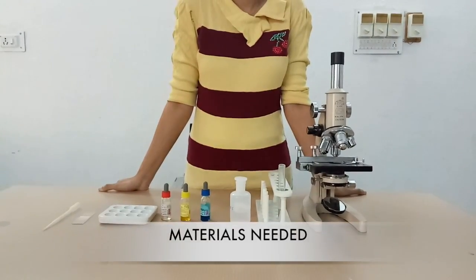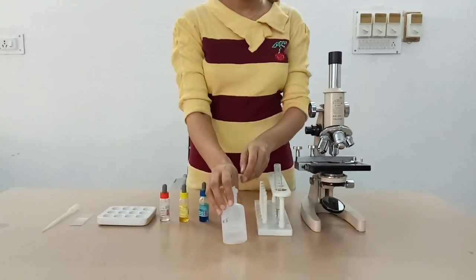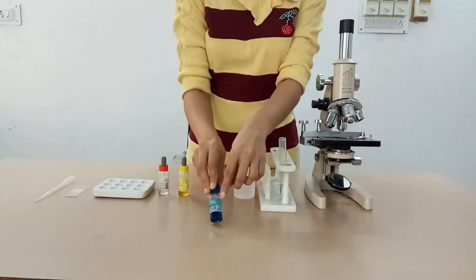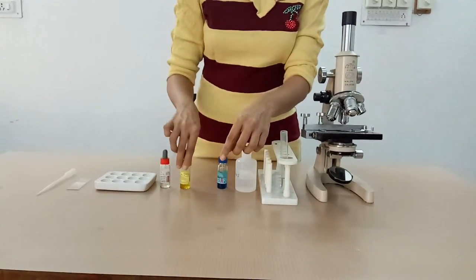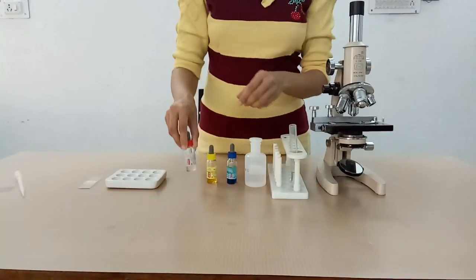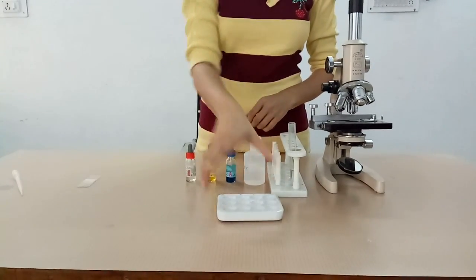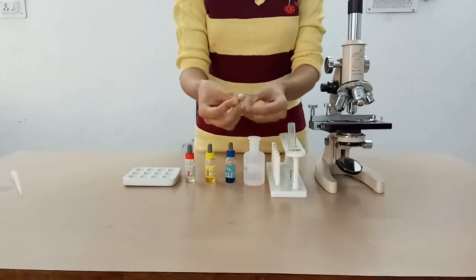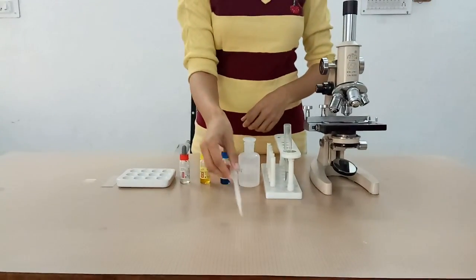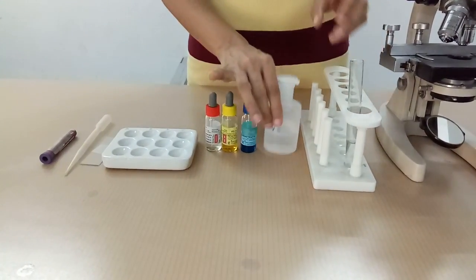To perform the practical, we require test tube, 0.9% normal saline, anti-sera, anti-sera A, anti-sera B, anti-sera D, porcelain tile, slide with cover slip, dropper, and microscope. Procedure: take 2 ml of 0.9% normal saline in a test tube.